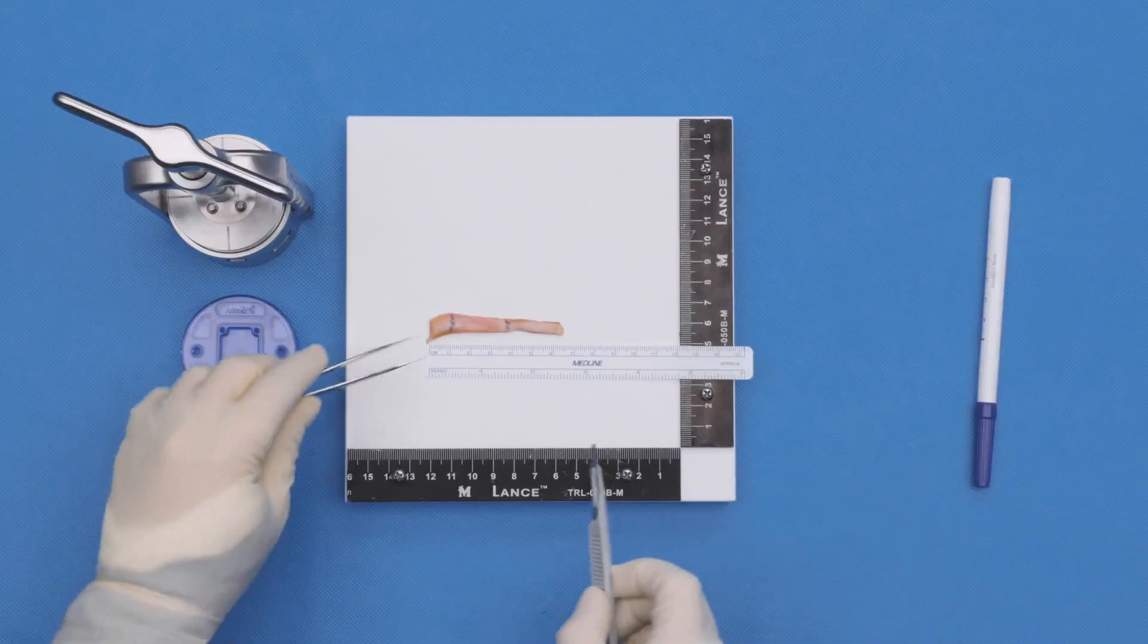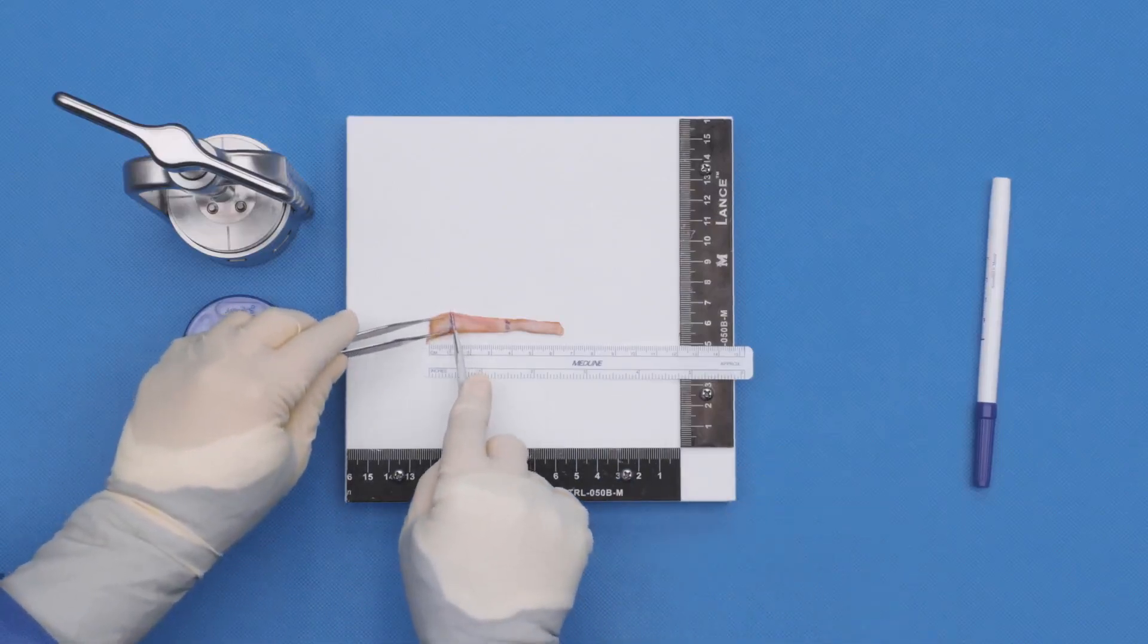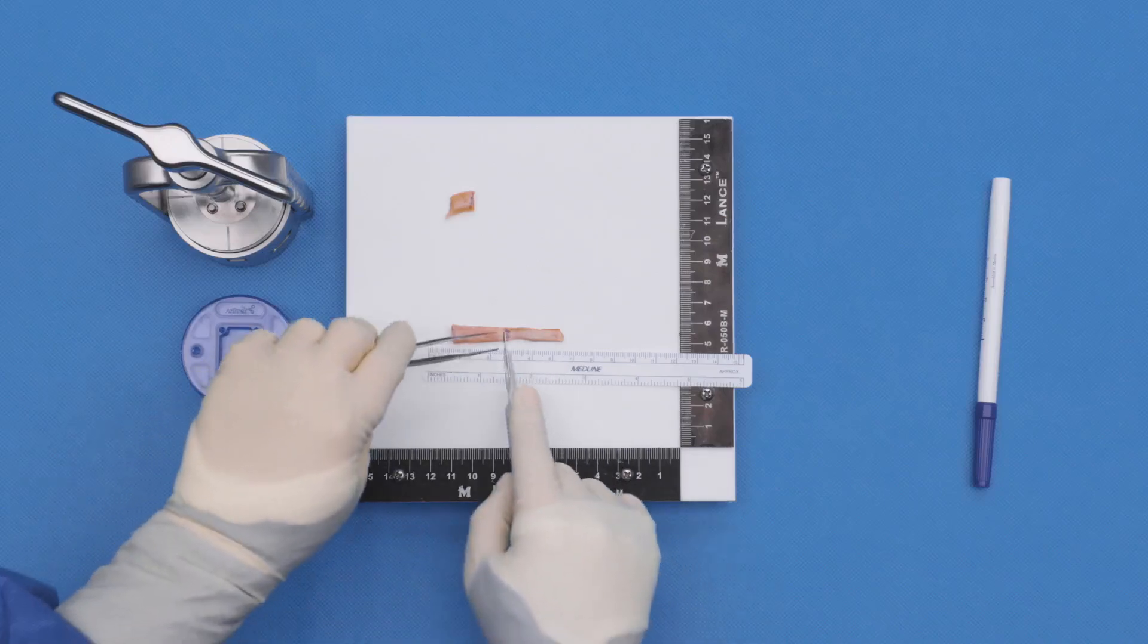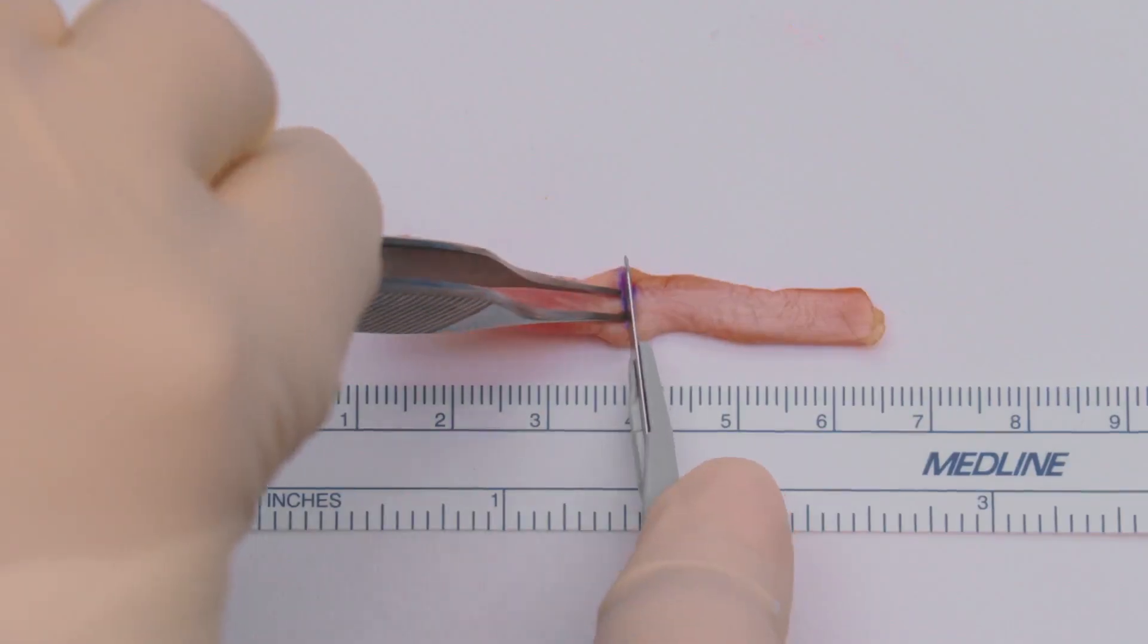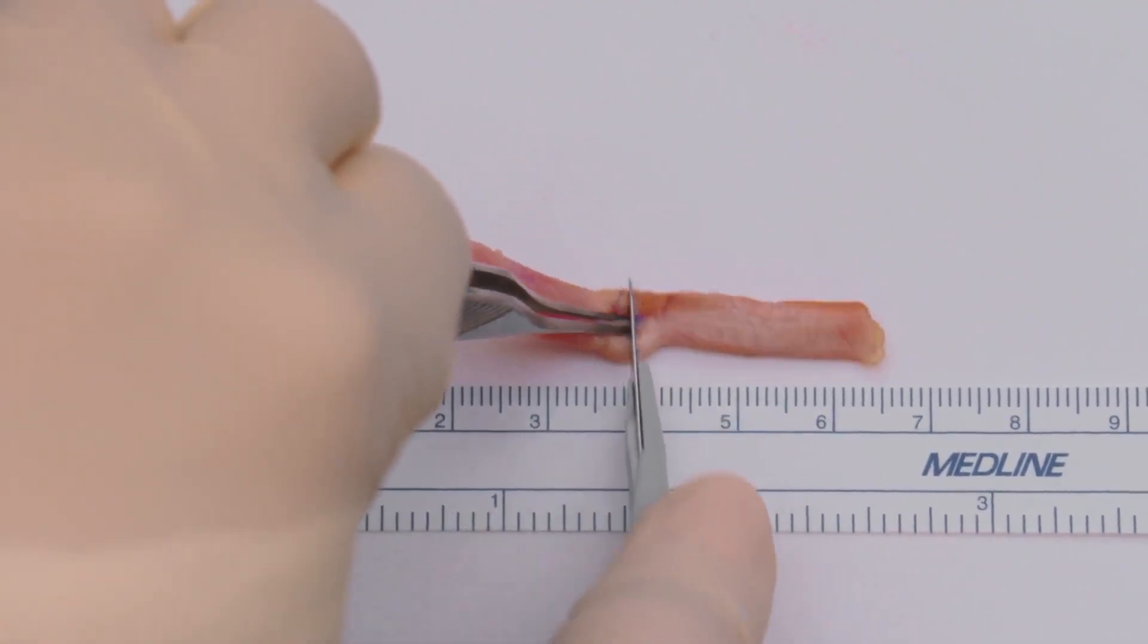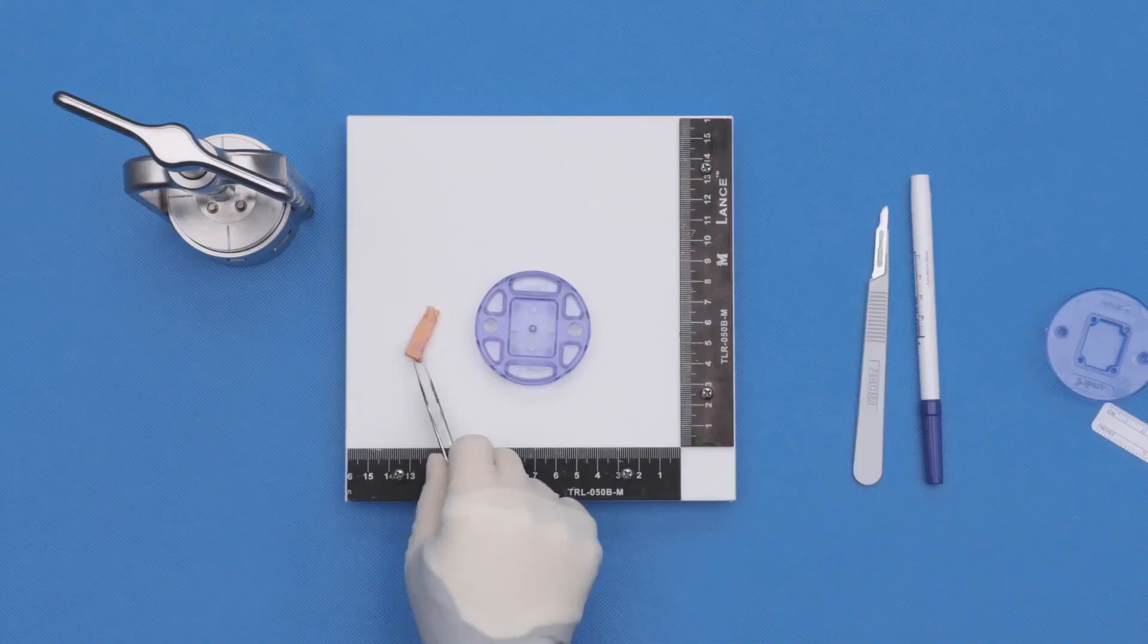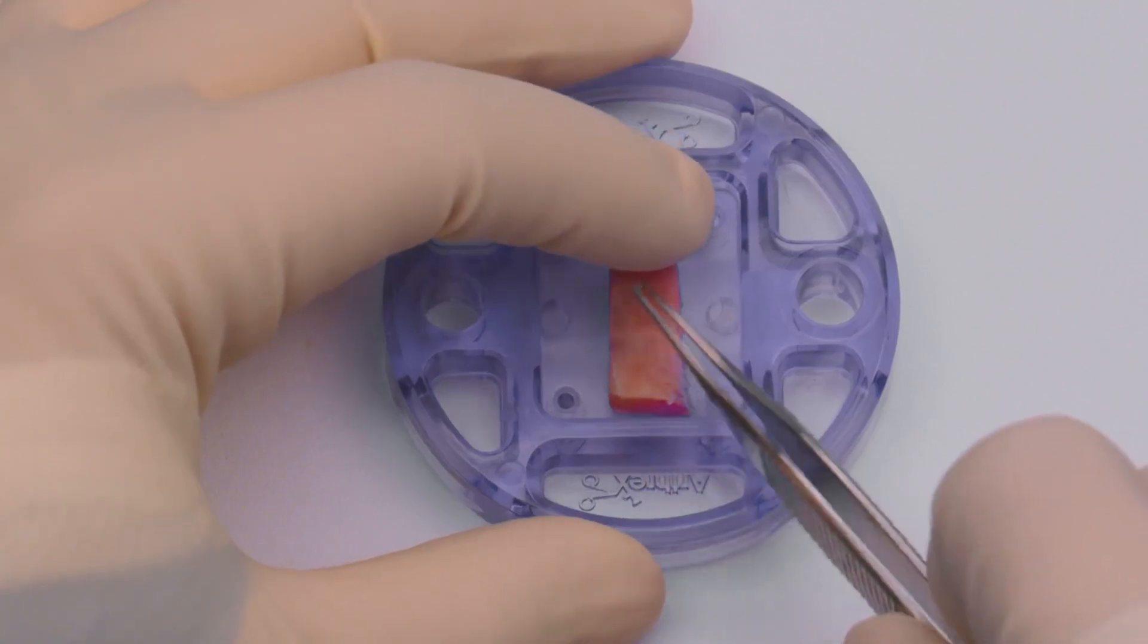Once the graft is harvested, remove and discard approximately 1 cm from the labral attachment point, since the tissue in that region tends to not smash well. Then cut the graft to 27 mm in length. The cut tendon can then be placed into the bottom well of the compression plates.